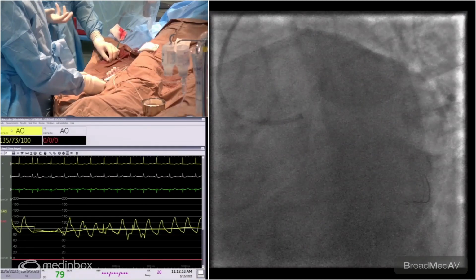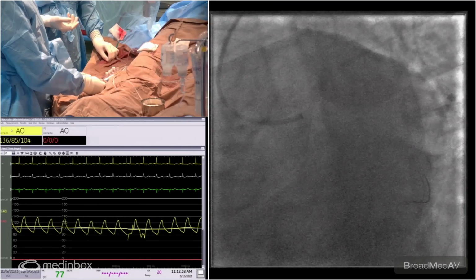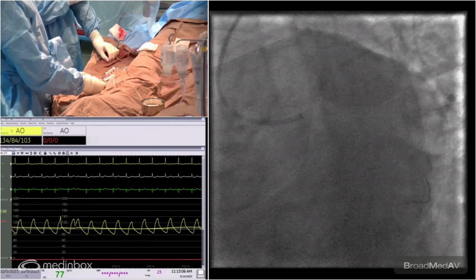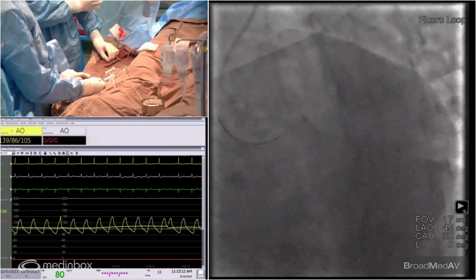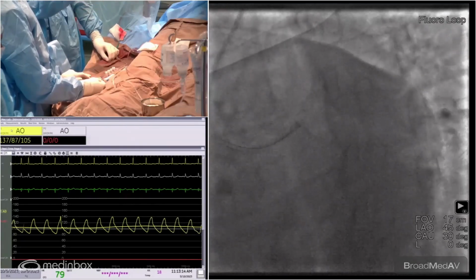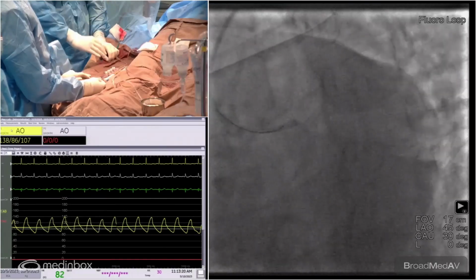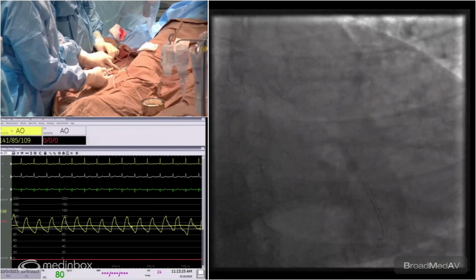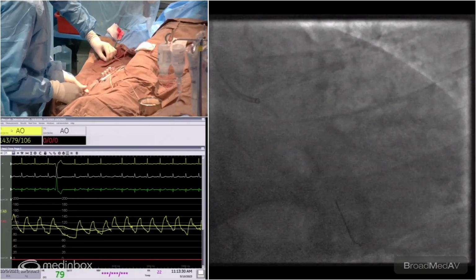2.5 balloon, please. This patient had a very short left main. Ideally, in radial, we have some difficulties, but I had taken a backup guide from the Terumo, and it is a 3.0, so that you can easily engage the LAD and the LCX as well. So it just needs a little anti-clockwise direction, and you face into the LCX. So I didn't have any difficulty in accessing the LCX with this guide as well. Okay, so Ashish, let's go ahead and pre-dilate. Yeah, no need. You just go direct. Sure.